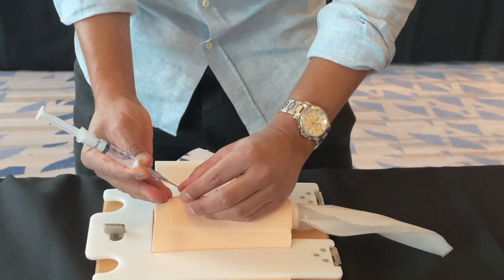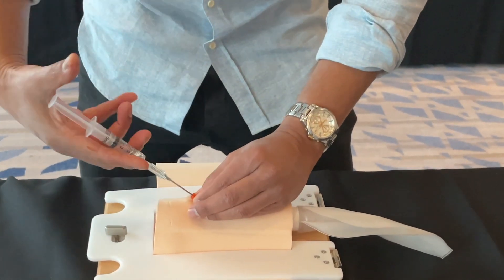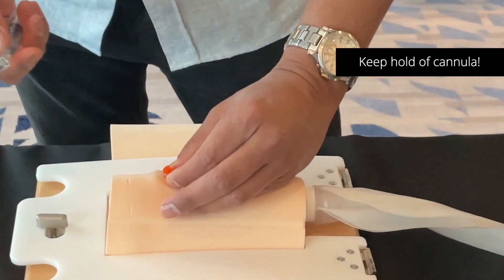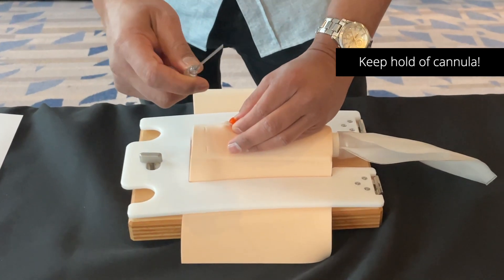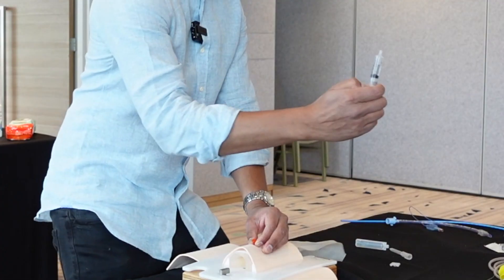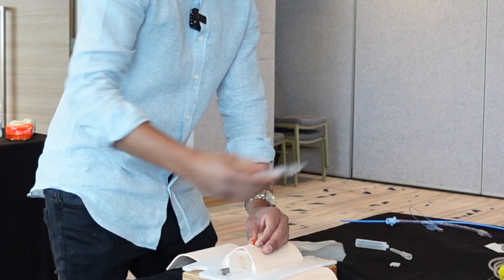Notice I'm not moving the needle at all. I've passed the cannula, and at this point I never let go of that cannula. I then take the needle off and put it in the sharps container, and using one hand, I get rid of that air.